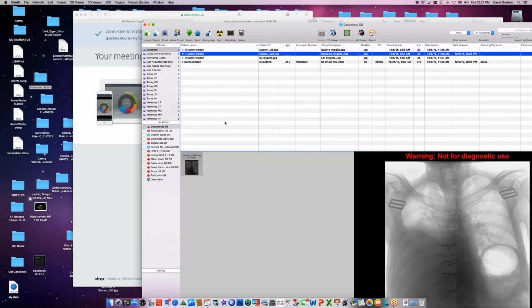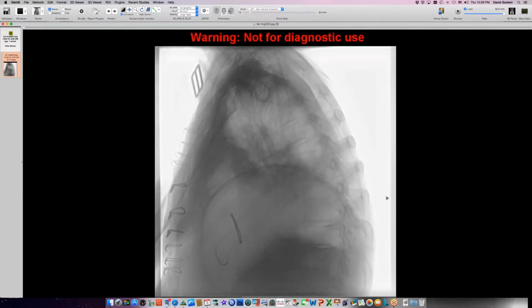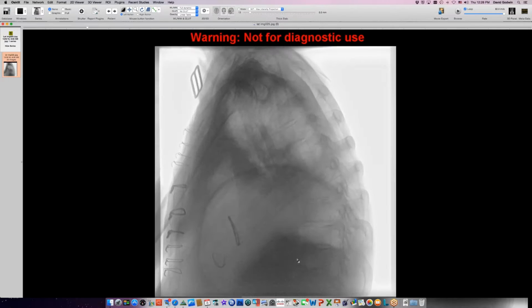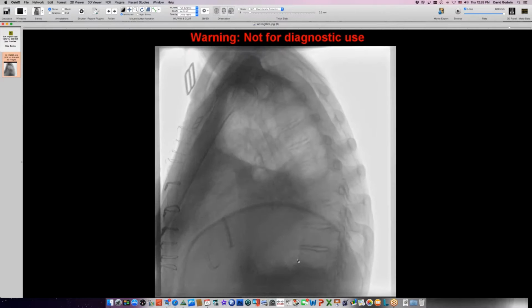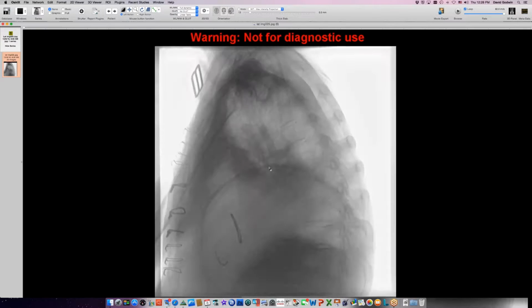We include a lateral view because the most vigorous diaphragm motion is posteriorly. So here's our elevated left hemidiaphragm with a lot of gas in his stomach underneath. And you can see that he's really got quite good excursion here on deep inspiration, and it's moving the same direction as the other side. The effusion is also moving down. You can see that he's got very vigorous chest wall motion. He's really sucking hard to take in a deep breath there.